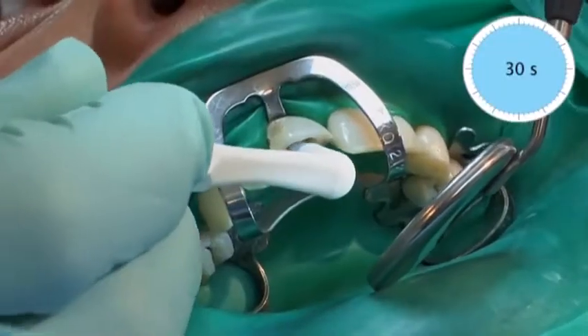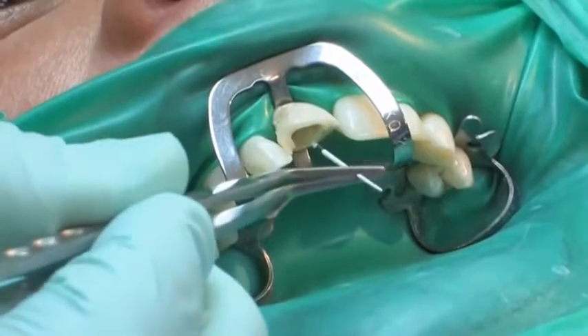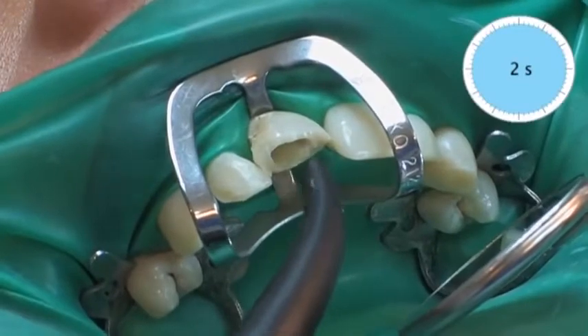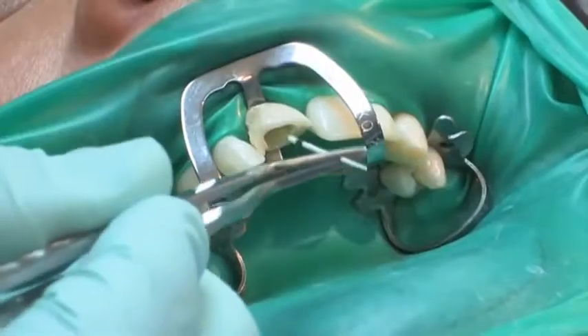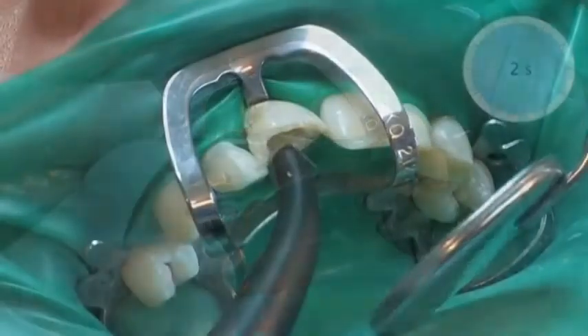Parabond non-rinse conditioner is massaged into the root canal and onto the tooth surface. Excess conditioner is removed using a paper point and dried using a gentle stream of air. The mixed Parabond adhesive is applied directly into the root canal and onto the tooth structure. Excess adhesive is removed using a paper point and carefully dried using a gentle stream of air.